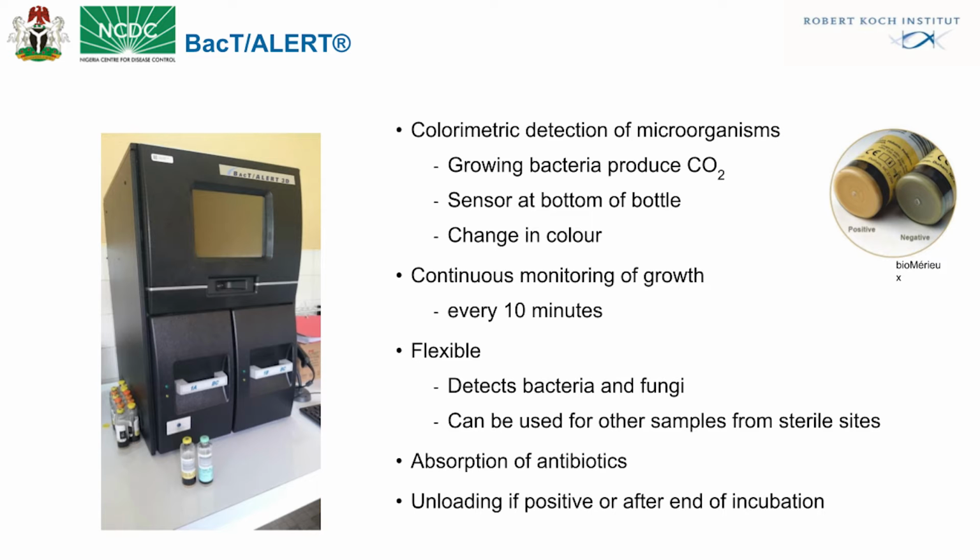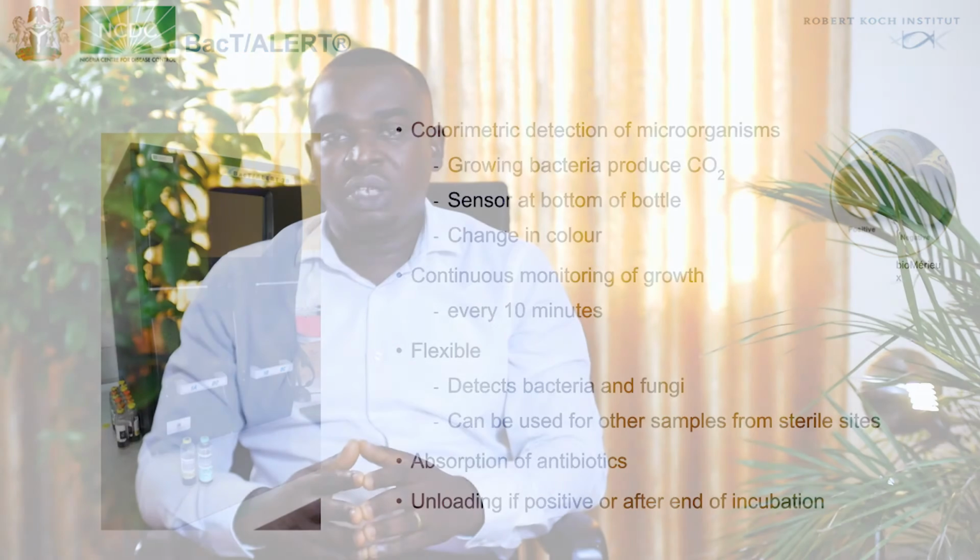And finally, the unloading of samples. It is so easy to unload both positive samples when they have signaled, or at the end of the duration of incubation, the removal of negative bottles. The sensitivity of the BacT/Alert system cannot be overemphasized, because it's a continuously monitored system. And every time there is a signal, that sample can easily be attended to and analyzed with all urgency.